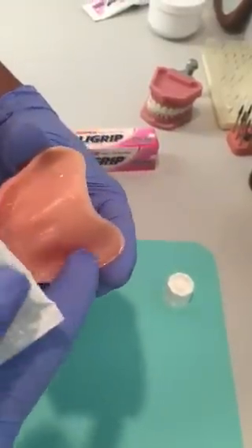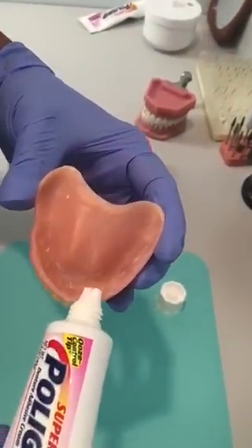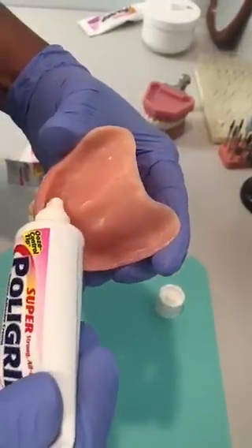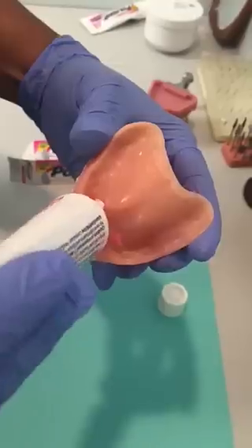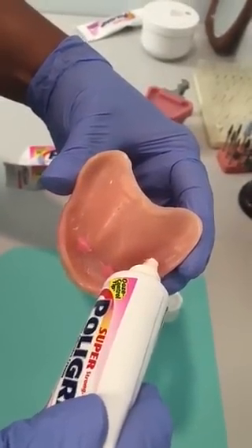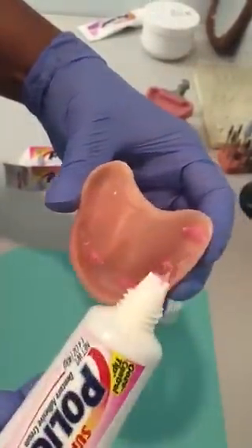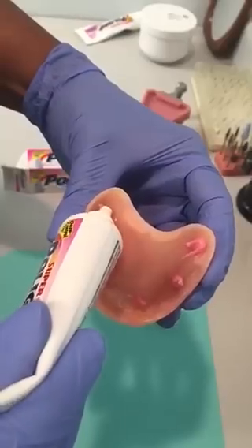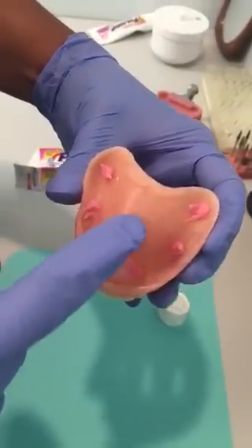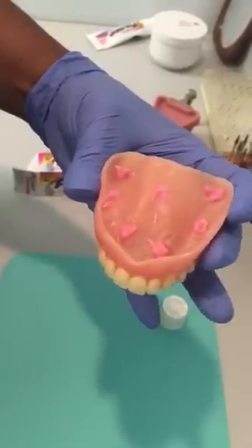For the upper, it depends on the amount of bone in the patient's mouth. This seems pretty average, so you place the same pea-sized drop in the area of the eye teeth — notice it's not a whole line, just a little drop — and in the area of the molars. Sometimes, depending on the amount of space, you can also use just a little on the palate.